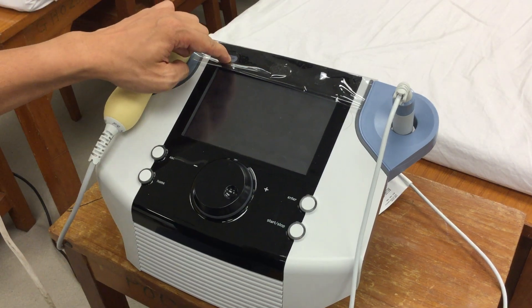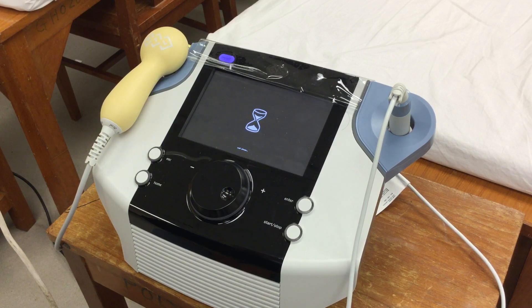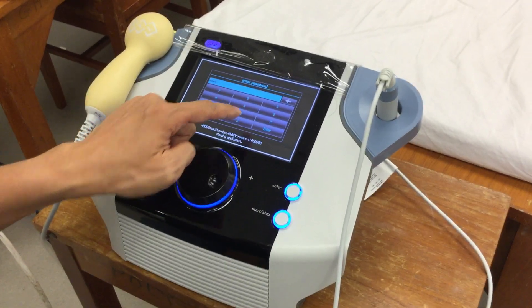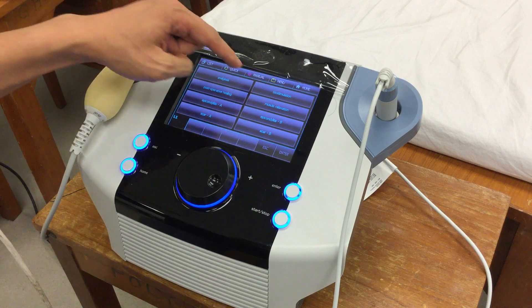What you need to do for this machine: you only need to turn on the device, and then enter the password which is 0000, and then go to the menu.